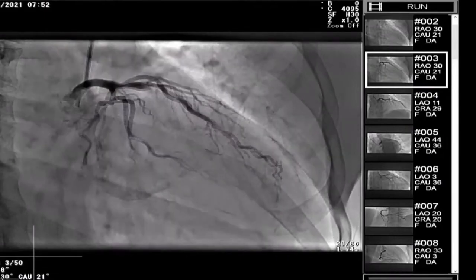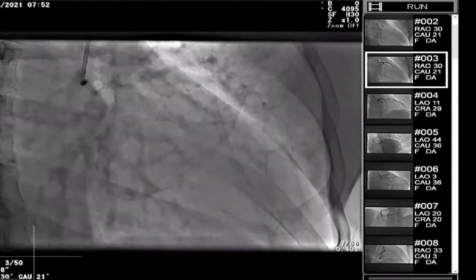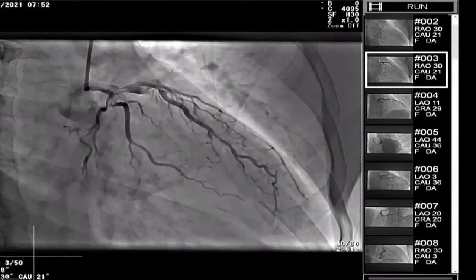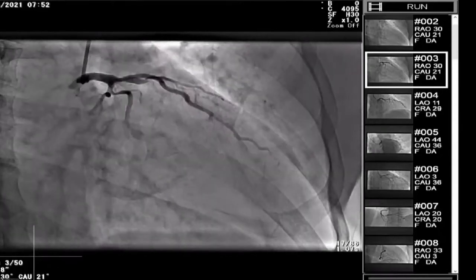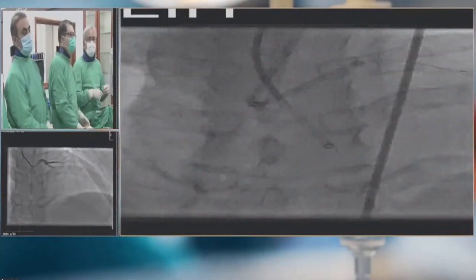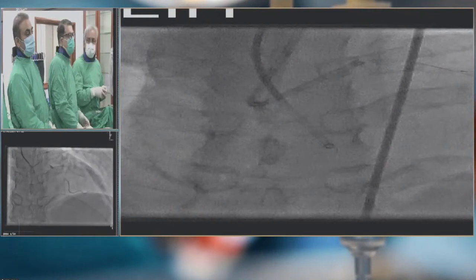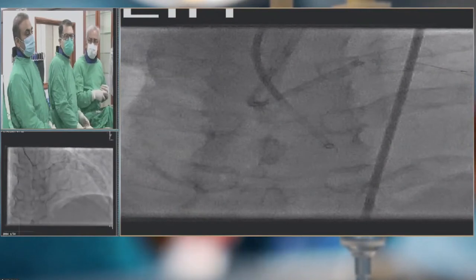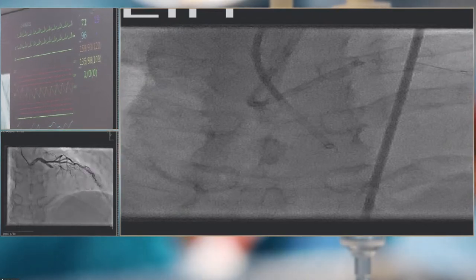The story is that this patient had acute inferior MI. And so they did a balloon angioplasty to the right coronary artery because they had taken pictures and saw CTO on the left side. And so when they did the right, they ballooned it and they left it alone. And so now they came back and took some more pictures, and we'll show you the procedure of today first. Can you show what happened this morning? So this morning, next please.